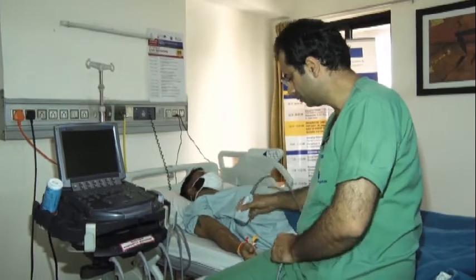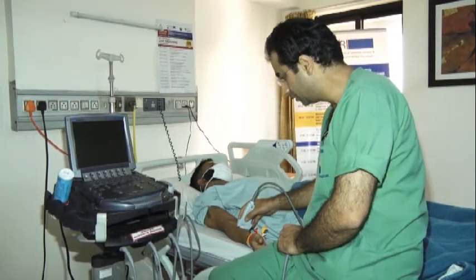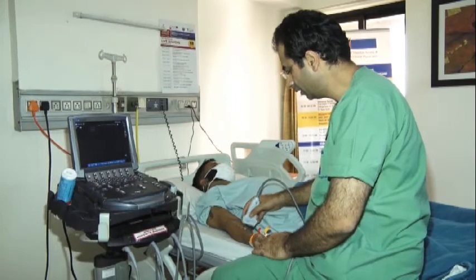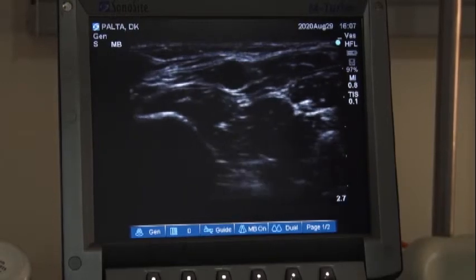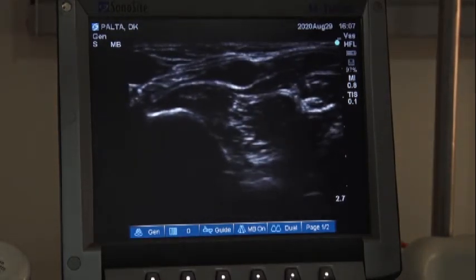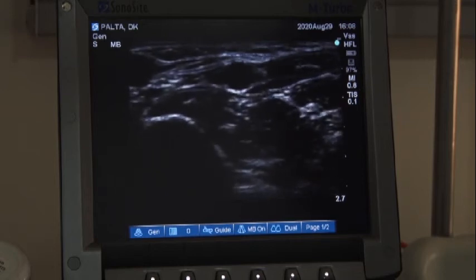Now we have this probe and the patient has a normally functioning fistula. First we'll screen the proximal radial artery, the feeding artery. This is the feeding artery. I will try to screen it. So this is the radial artery with the vena comitans, a good caliber artery. I'm scanning 4 centimeters above the fistula, that means 4 centimeters proximal to the anastomosis.